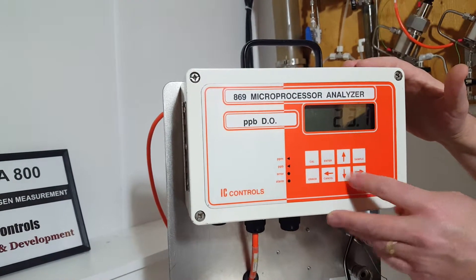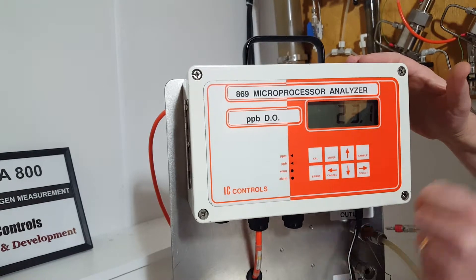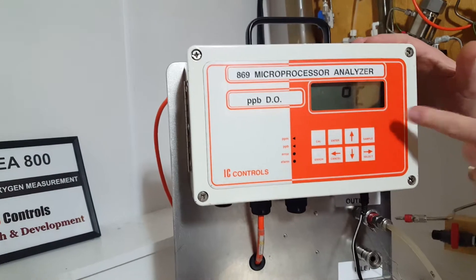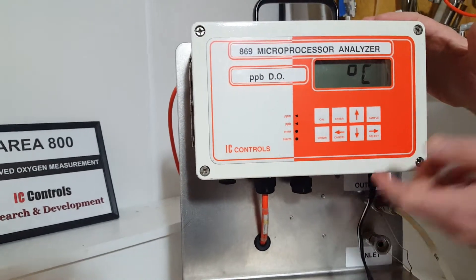If you go down, there's your temperature in degrees Celsius. If you hit the back arrow, it tells you what your reading is. You can also change that in the program to Fahrenheit if desired.